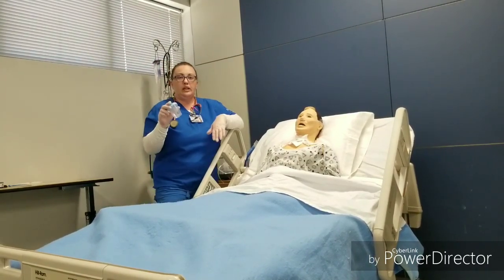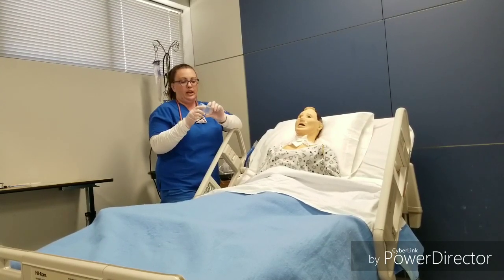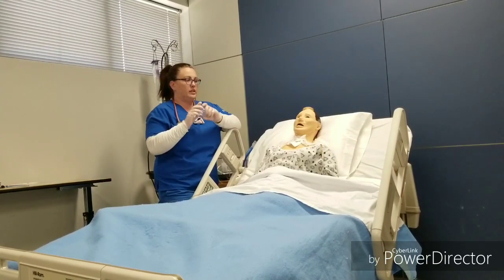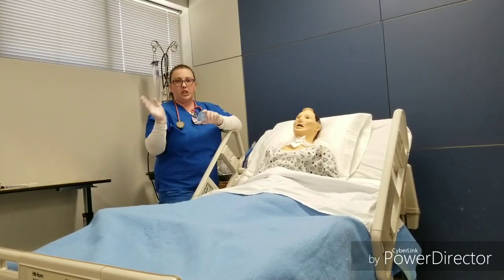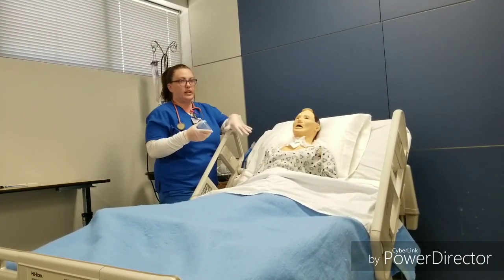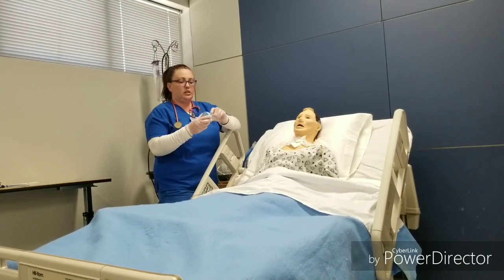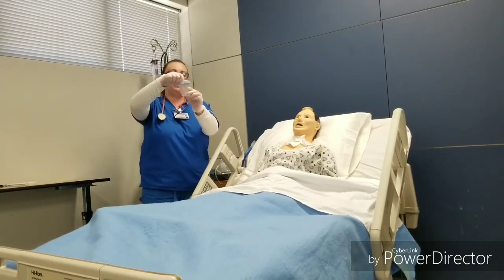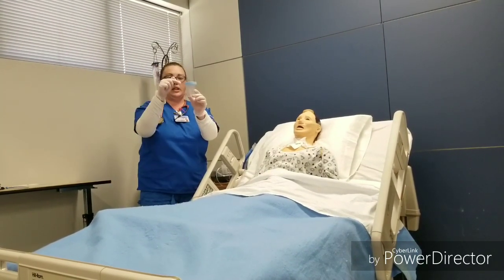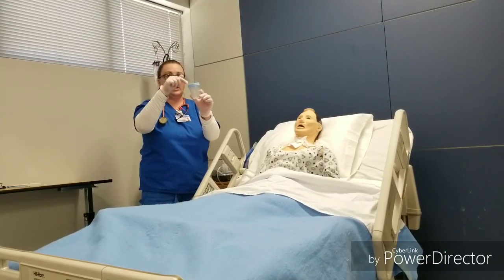Now we're going to do a sputum specimen culture. And you will need a sterile specimen cup for this, some gloves, and I have checked my orders, performed hand hygiene, gathered my supplies, identified the patient, explained the procedure to the patient. So now I'm going to remove the lid off the sputum specimen cup. Make sure not to touch anywhere inside the cup, because inside the cup is sterile.